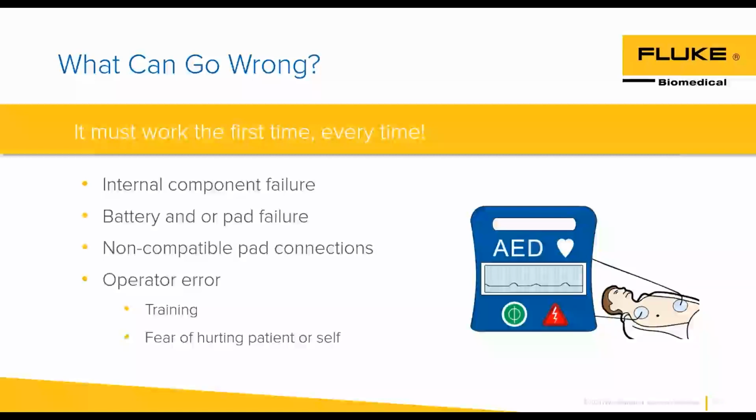Now you have a first response, you might have an ambulance. So when that ambulance shows up to take care of that patient, the general citizen uses the AED and it has one style. Well, now the medic shows up and they're going to use their defibrillator with its built-in AED. And all of a sudden those pads aren't interchangeable. So you've got to rip the first set of pads off the patient's chest and put a second set of pads on. It can happen again when you go to put that patient onto a helicopter to transport them in an emergency situation where the helicopter doesn't have the same pads as the ambulance does.